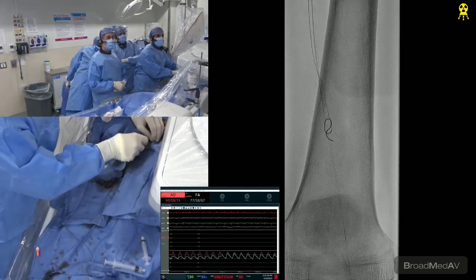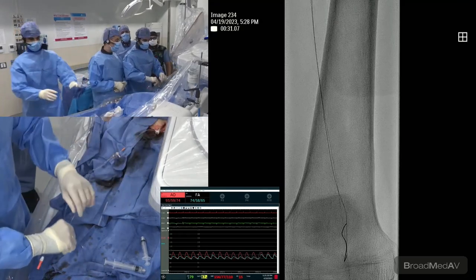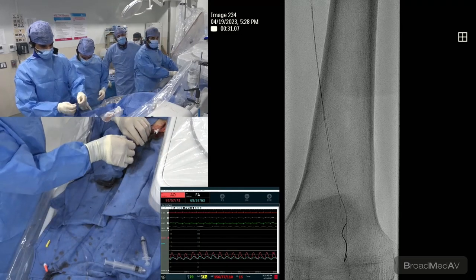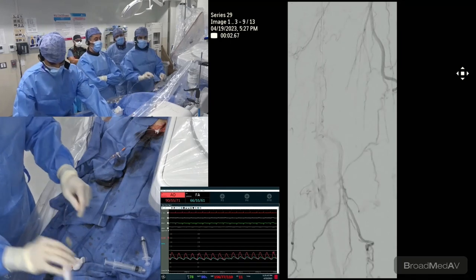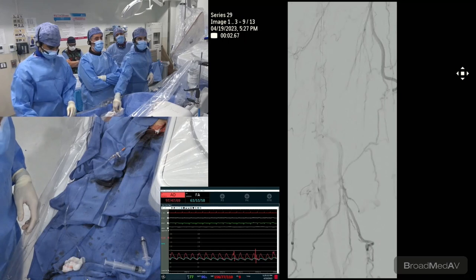And now we're going to lose the loop at this end. Now look at that pressure difference just across the lesion. Yep, that's it. Good. Now look at that. So right now you have an angiogram. Show the angiogram again, Vishal. You have an angiographically perfect-looking lesion with a balloon angioplasty. Physiologically, that lesion is not perfect.